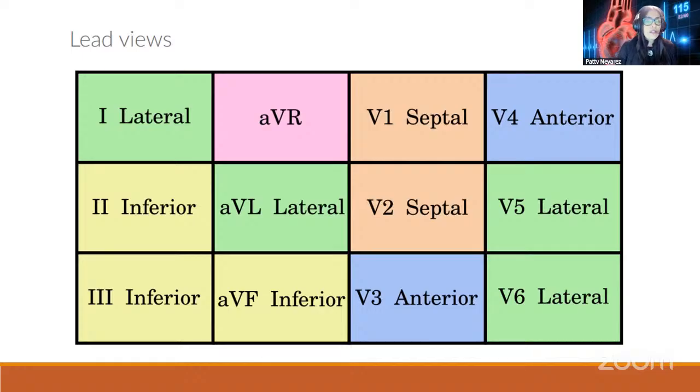aVR does not give us a lot of information because there's not much to see on that side. So it has its function for other stuff, but let's move forward.